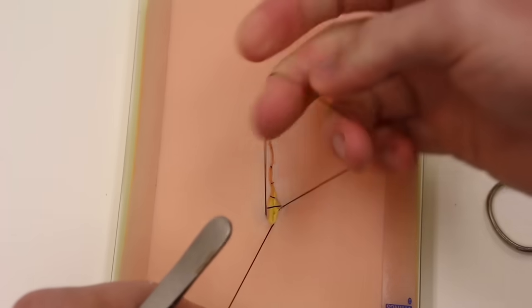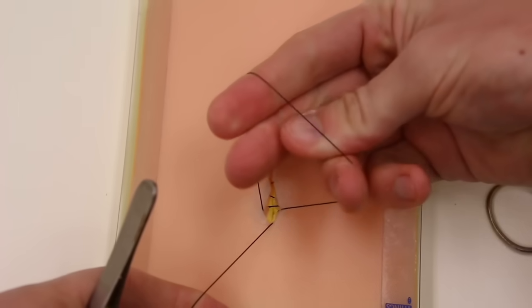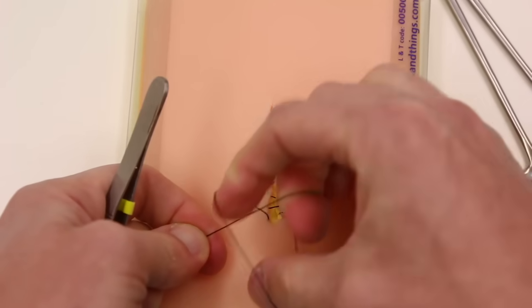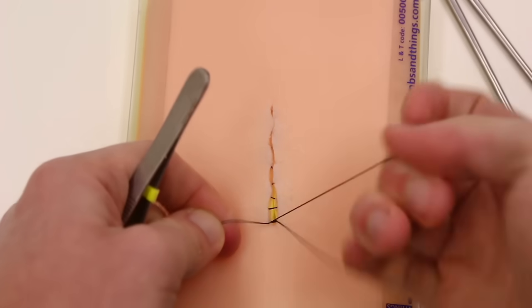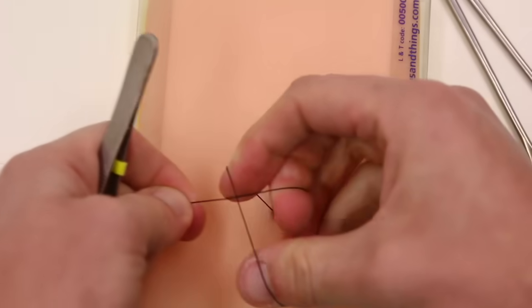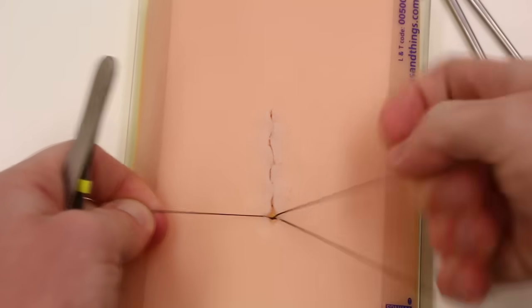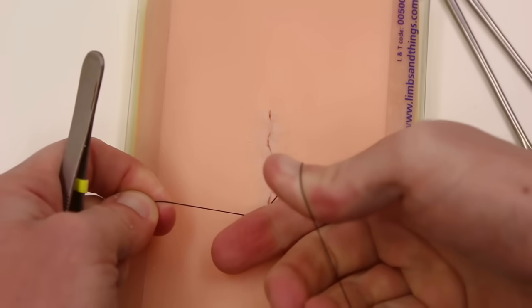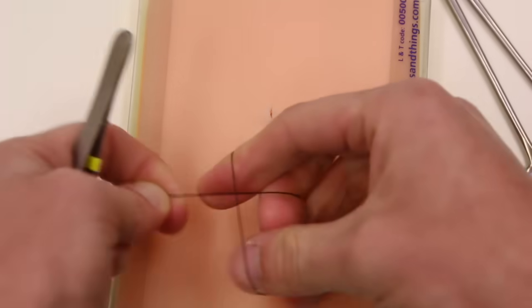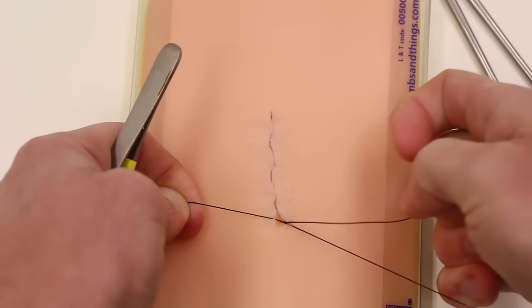So there's a little hitch you tie here, putting your fingers through your loop, grabbing that free end and pulling through, kind of rotating the suture. Fingers through the loop, grabbing that free end, rotating. This second knot here is where you can really tighten. And then the third knot locks it.